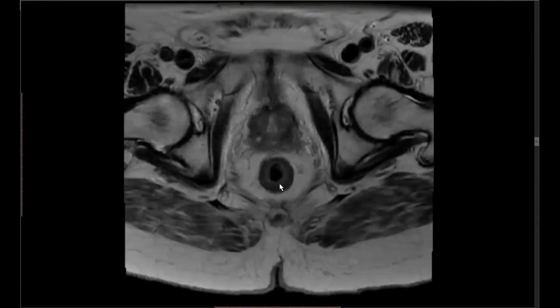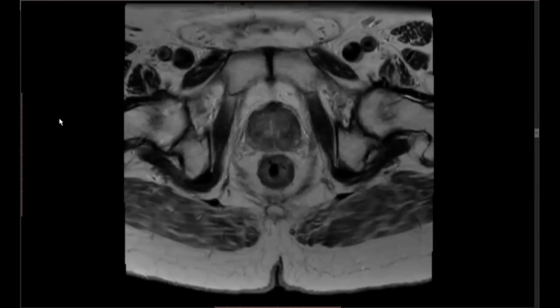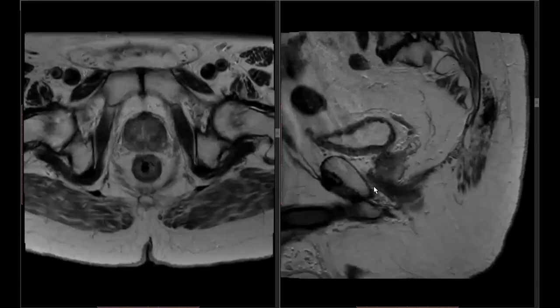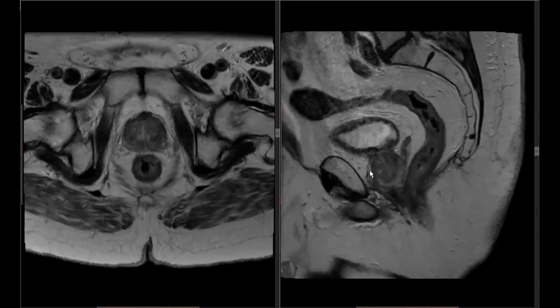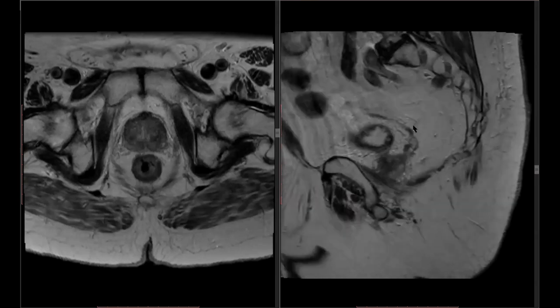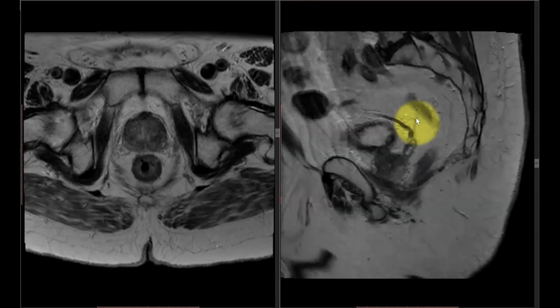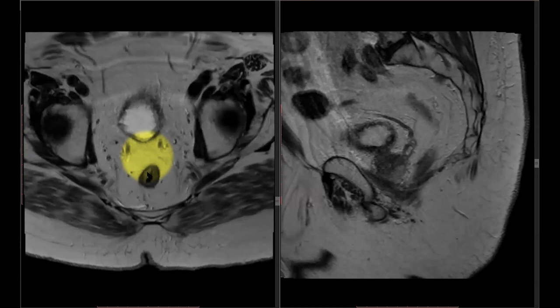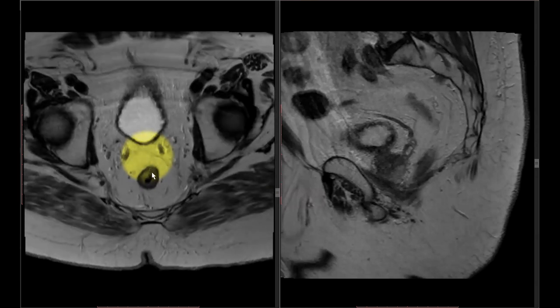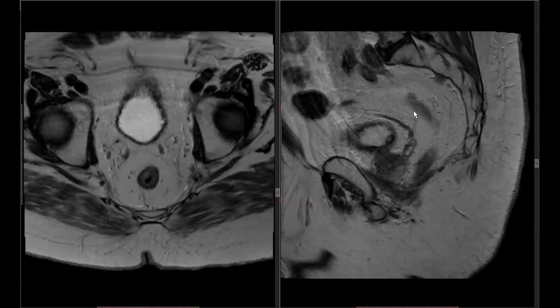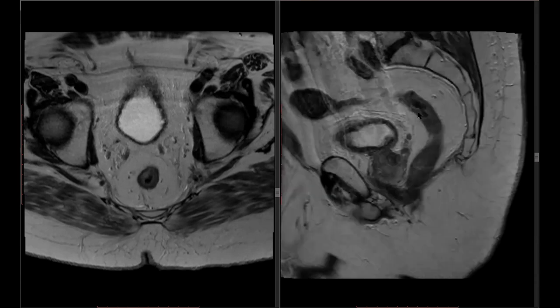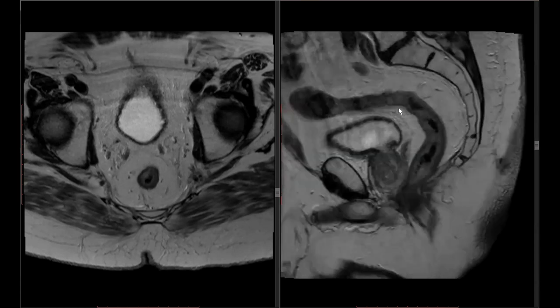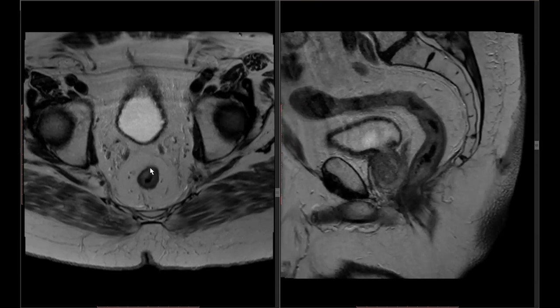The lower rectum is entirely extraperitoneal. As you come up superiorly — looking at the sagittal image in a male patient with the prostate and seminal vesicle visible — extending posteriorly from the tip of the seminal vesicle is a thin black line, which is the peritoneal reflection. On the axial images, it is seen as a subtle gulving or insertion. Below the level of this peritoneal insertion, the entire rectum is extraperitoneal. Above this level, the anterior part of the proximal mid-rectum and upper rectum has a peritoneal lining anteriorly.